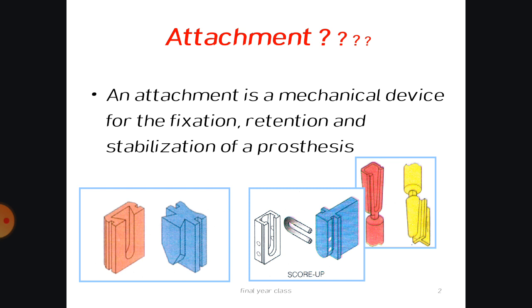There are advantages and disadvantages in relation to this kind of attachment retained denture. The advantage being it is more aesthetic and it is more retentive compared to the normal dentures.